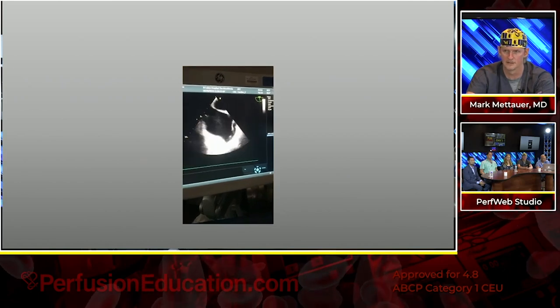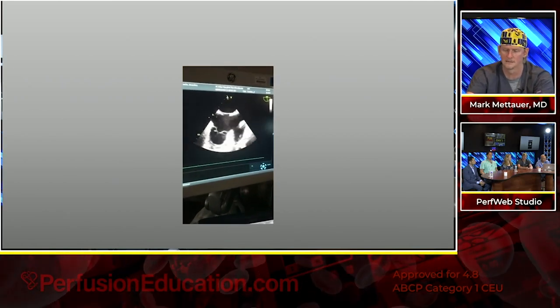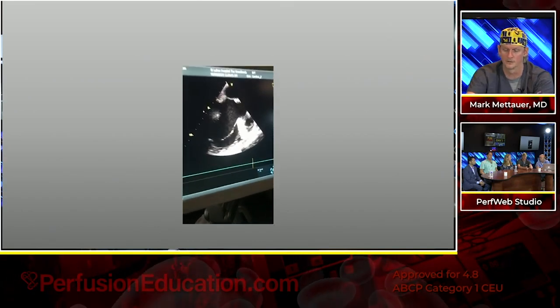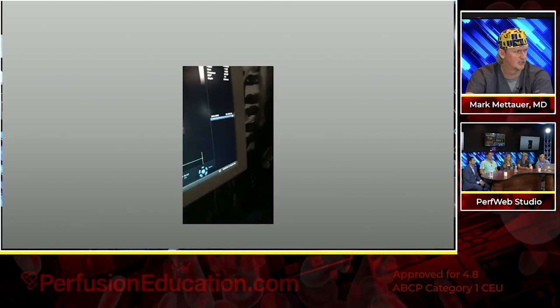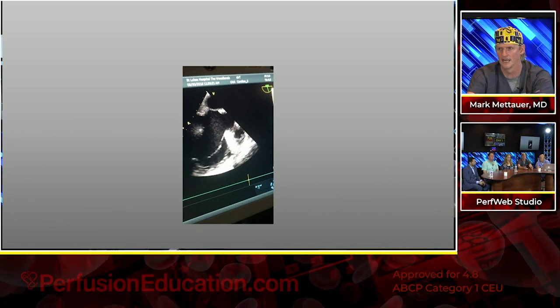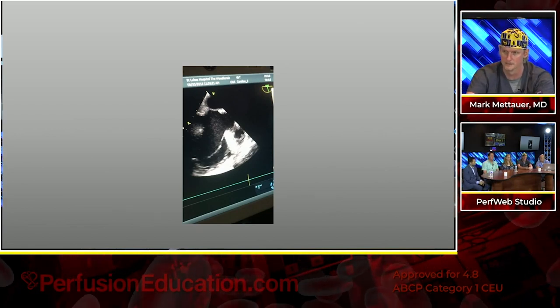Today was a little bit interesting because you could tell it had snared it, because part of the cast or the clot was not moving. And the more distal end was, and it was quite a large one too, because it was in the shape of the iliac vein. You can obviously tell it was the iliac vein because it was much bigger, and the catheter had a hard time pulling it through. But you just got to persist.